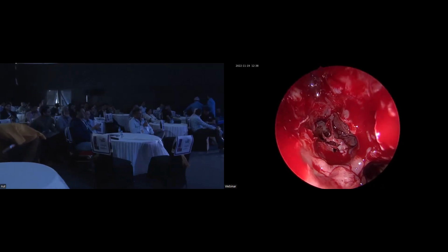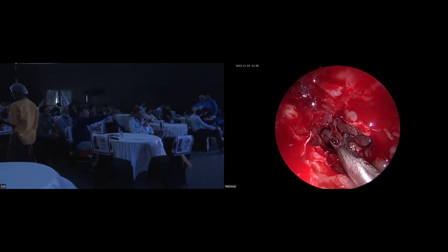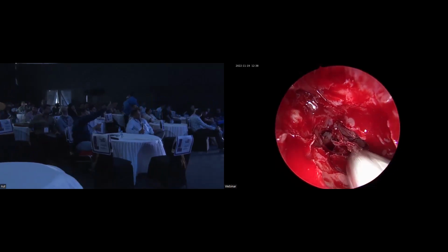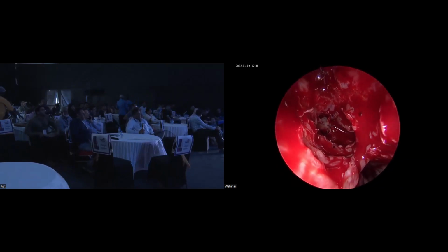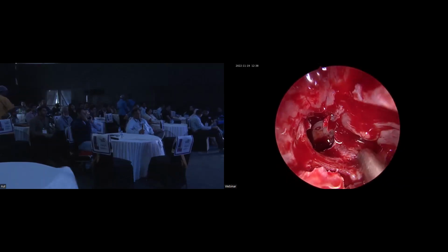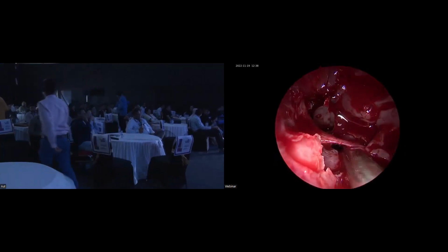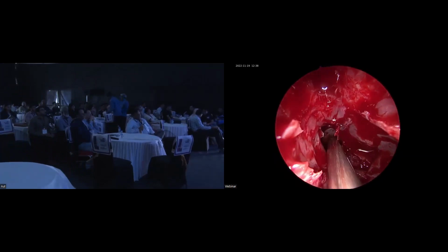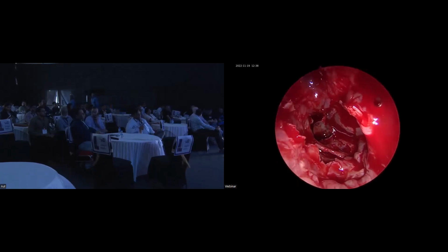Straight forceps, please. Stay over. Take them back. Give me the regular so that I can remove the polyp, bony spicules. Lateral, is it? That is not the anterior posterior cell. No, this is not Onodi. Onodi must be above and lateral. No, no, here is a sphenoid. Oh yes, this is a part of Onodi only. That is the one. This is better.